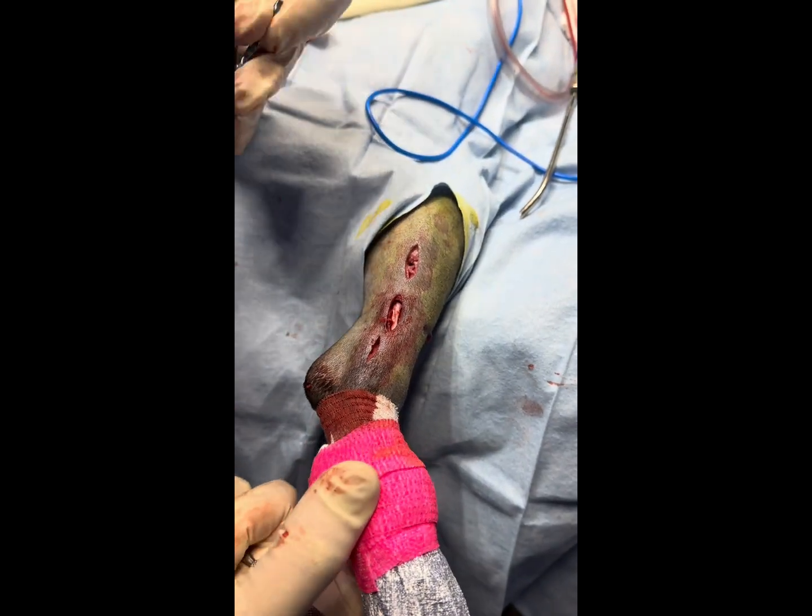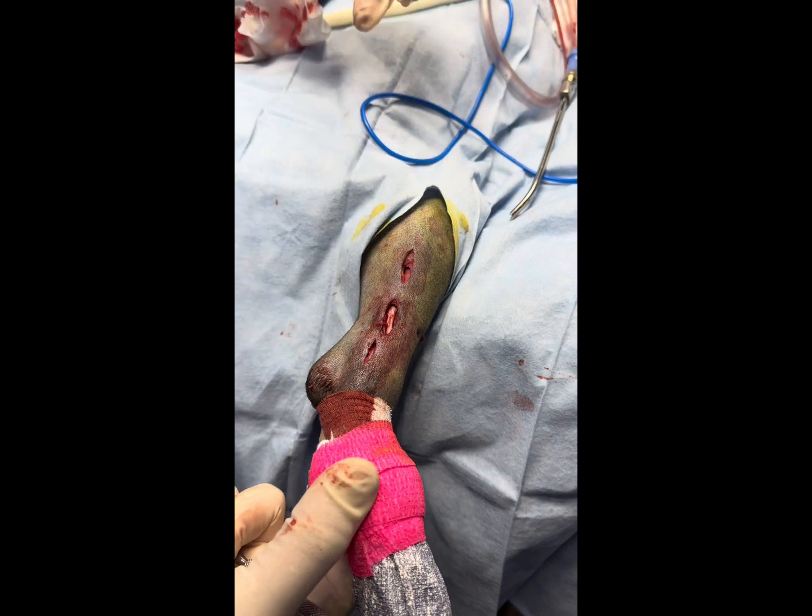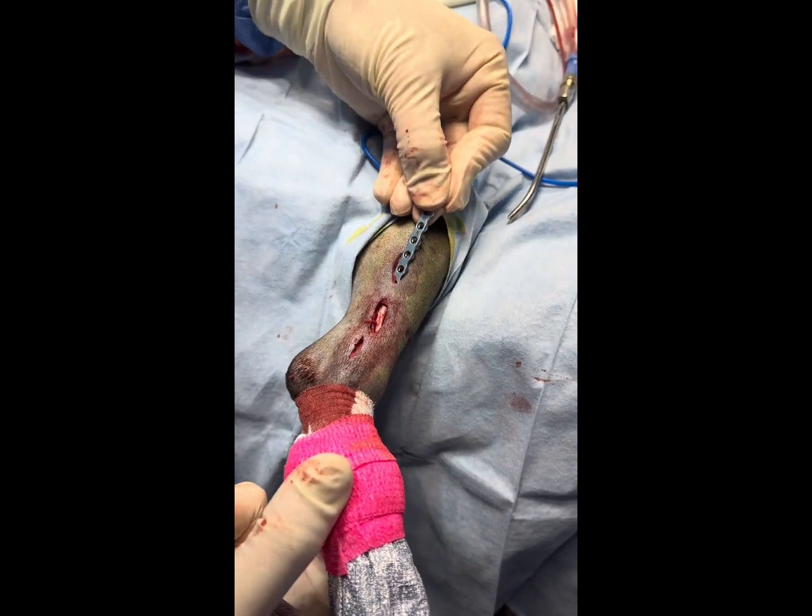We have our three sites prepped to the bone. Our fracture is here in the middle, so now what I'm going to do is run the plate down the tunnel that I've created.